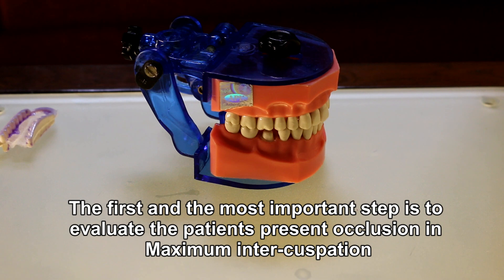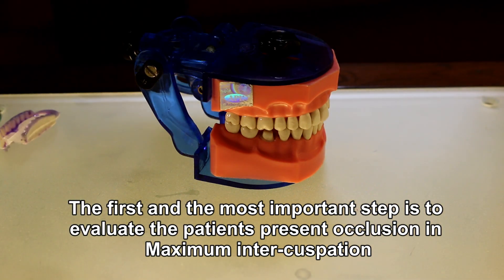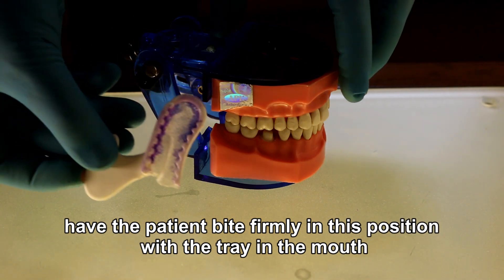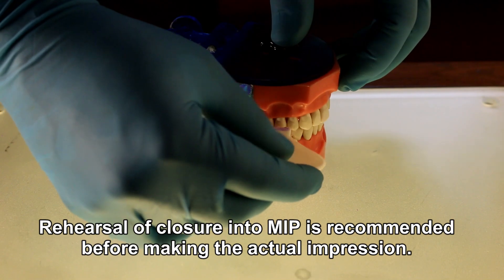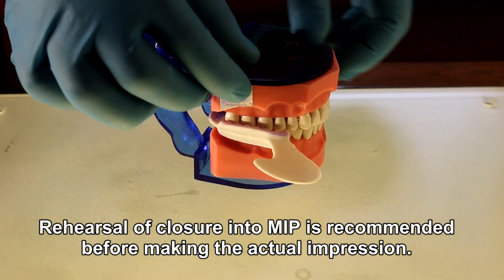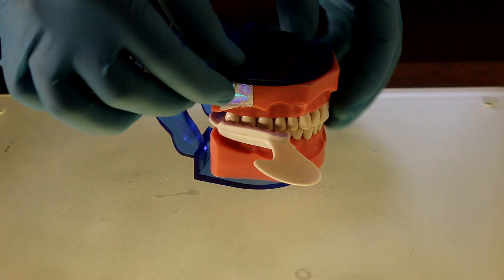The first and most important step is to evaluate the patient's present occlusion in maximum intercuspation. Have the patient bite firmly in this position with the tray in the mouth. Rehearsal of closure into maximum intercuspation is recommended before making the actual impression.